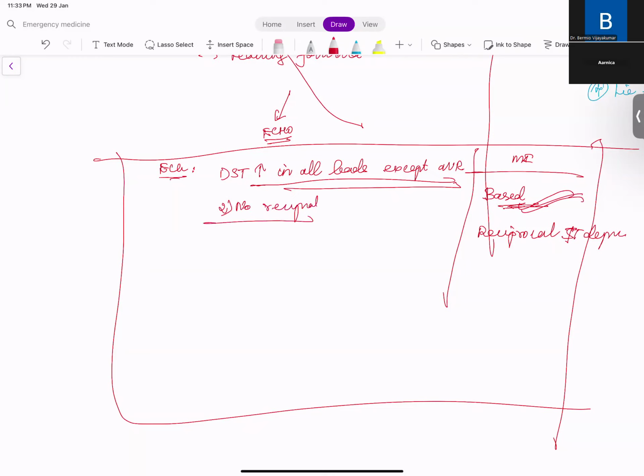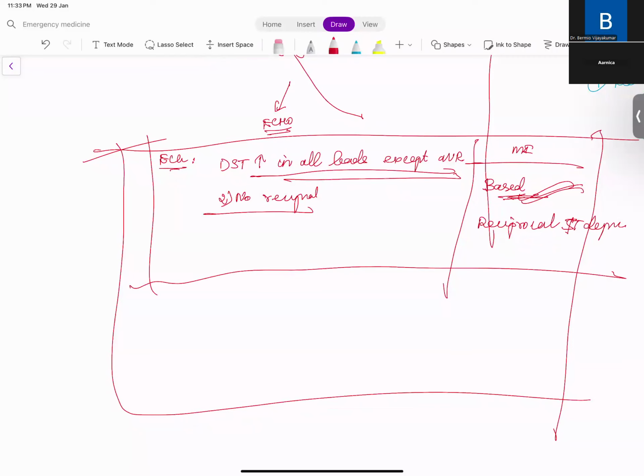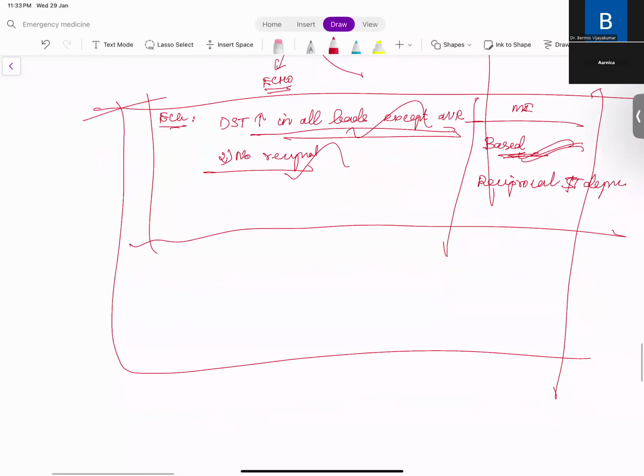There are other features also, but we will not discuss that. So if the patient is showing non-anginal, pericarditic type of chest pain, again, as discussed first, ECG should be done in every case of chest pain and abdominal pain. If there is ST elevation in every lead and no reciprocal change, it probably would be pericarditis. Refer them to the higher center for echo. If there is pericardial effusion or pericardial inflammation, that's a separate evaluation. Whether it is infective, tubercular, toxic, or post-MI, there are many causes.